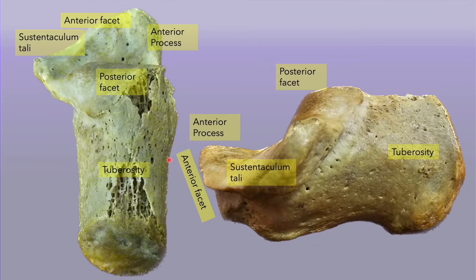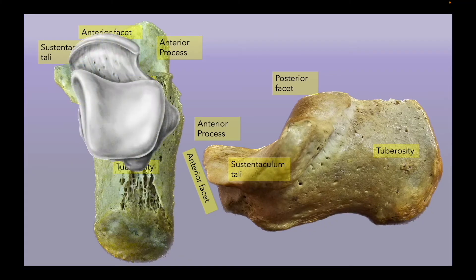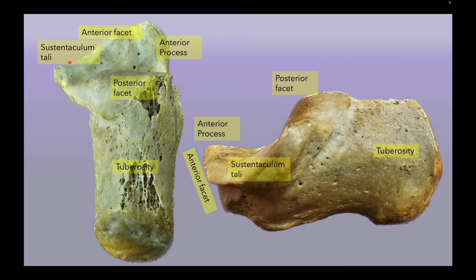When we see the calcaneum from above, this is the lateral part and this is the medial part. The posterior facet we have already seen — this is kind of an end-on view where our viewing angle is directly parallel to the posterior facet. Now the anterior facet is becoming more clear. The undersurface of the talar head rests on this part, and this is the sustentaculum tali. The anteromedial part of the talar head articulates with the sustentaculum tali. The anterior facet is just anterior to the angulation — the junction of the posterior facet with the anterior part of the calcaneum.